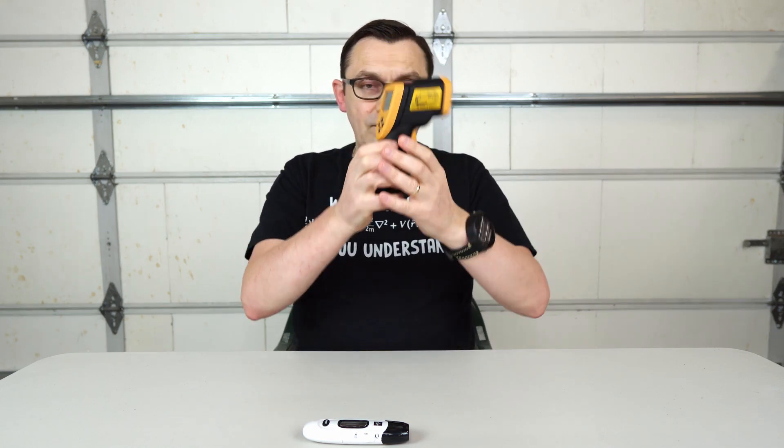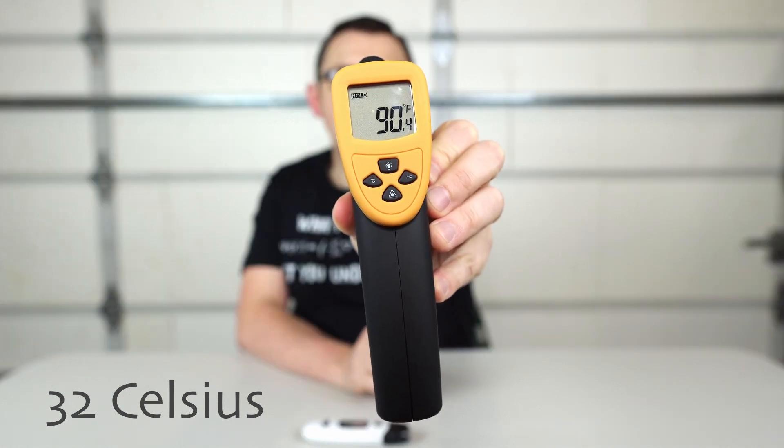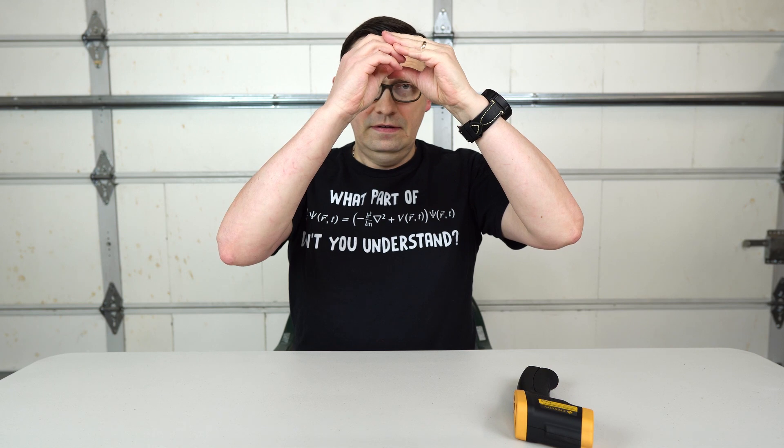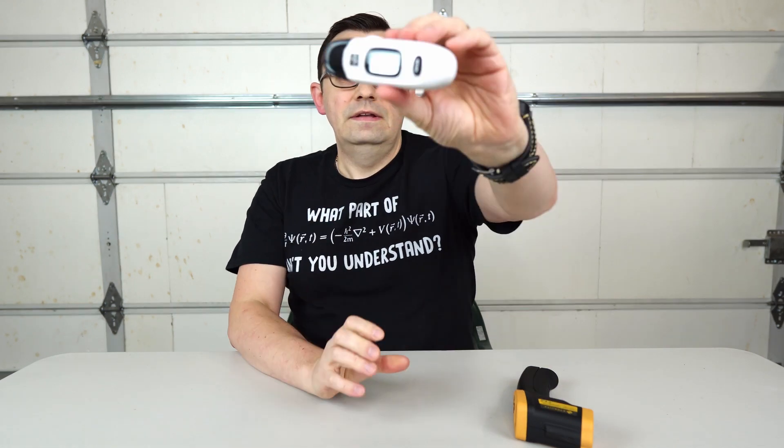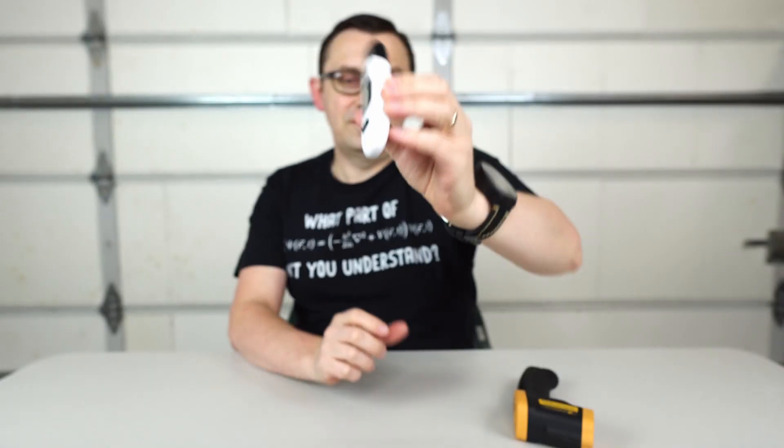Well, let's check it again just to make sure. 90.4 degrees Fahrenheit. Look at that. And I'm going to check with this one as well. 97.9 degrees Fahrenheit. Again, big difference.